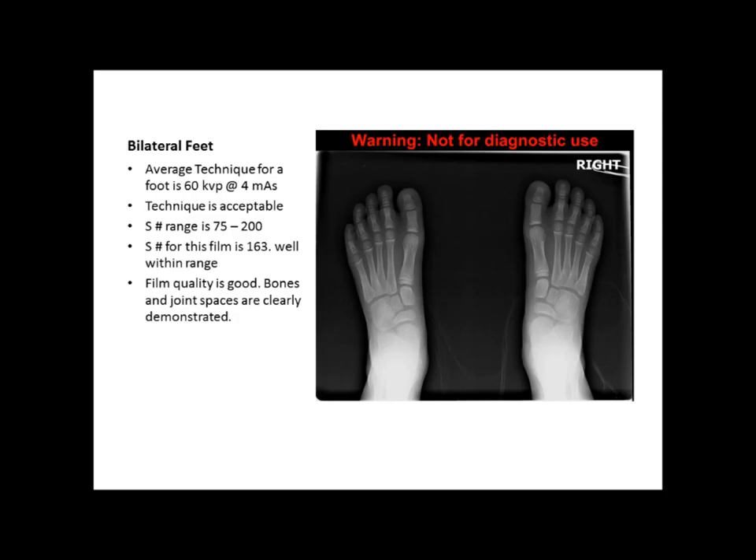Our first image is some bilateral feet. The film looks like it's exposed pretty decently. We can see the joint spaces are very clear and the bones are also very clear. The S number for this particular film is 163, which is well within range because the typical range for bilateral feet is between 75 and 200. The technique used was 60 kVp at 4 mAs, and that's about right.